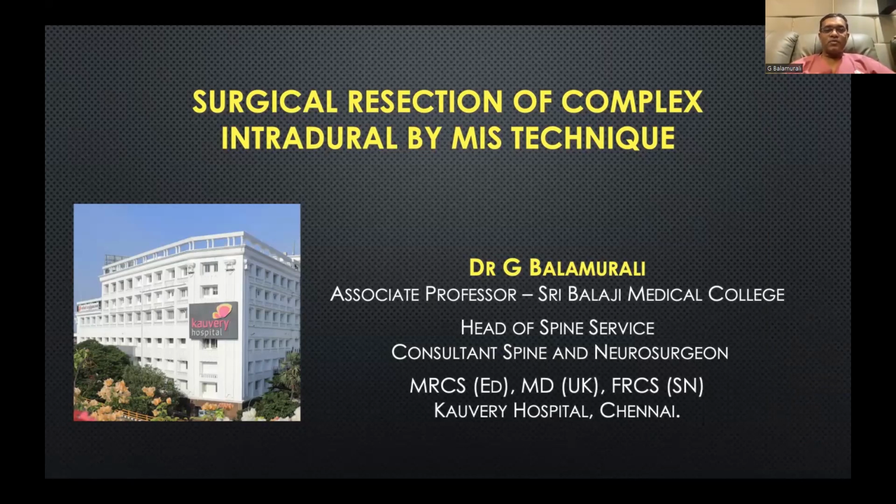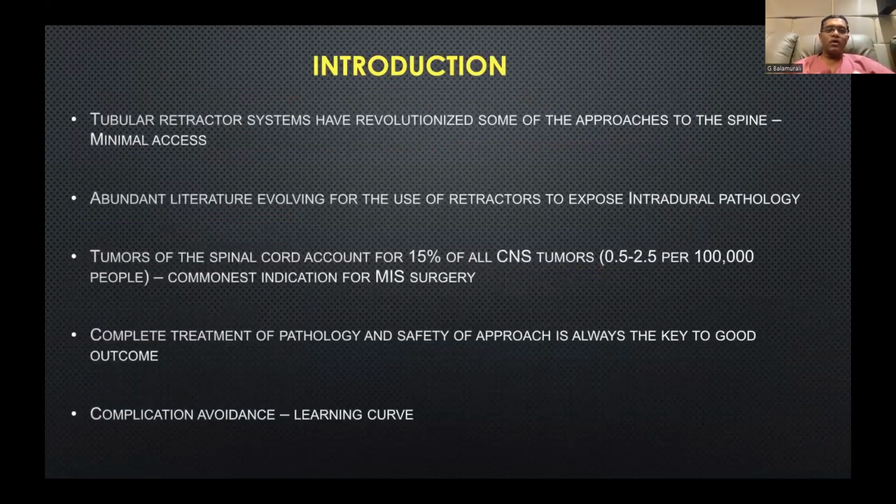Today, I'm going to talk to you about surgical resection of complex intradural tumors through minimally invasive techniques. We all know that tubular retractors have now become common use in disc surgeries and decompressions, and people have slowly expanded the use for intradural work as well. The most common intradural work that we do is for tumors, and also for various other intradural pathologies like syrinxes, tethered cords, and various other things.